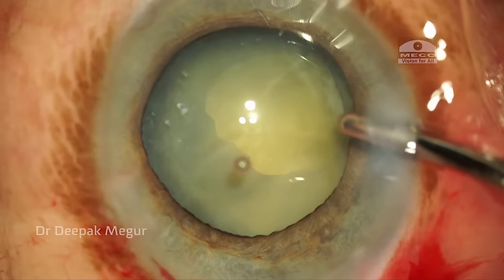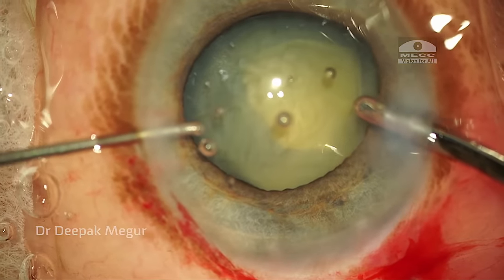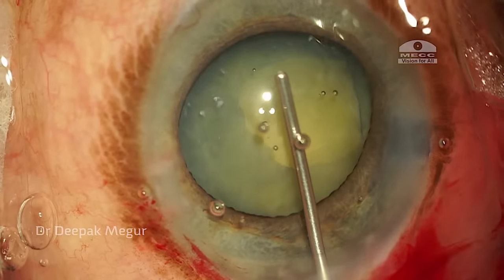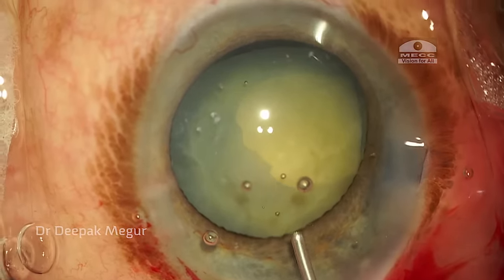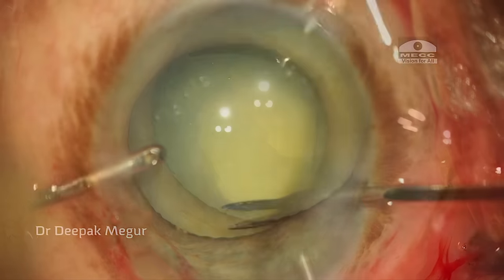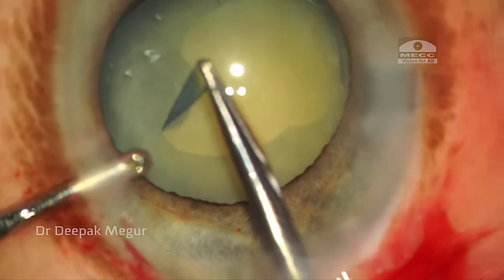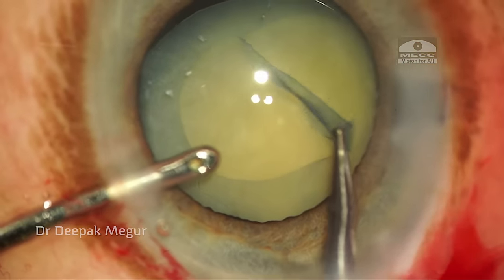Before removing the irrigating handpiece, I don't want to lose the chamber, so I inject OVD through the other end before removing it, filling the chamber with a little OVD. Now the plan is to enlarge the anterior capsulotomy opening a little bit using micro scissors — I make a small tangential cut on the anterior capsule, then using the Haldipurkar forceps, I enlarge the capsulotomy to an adequate size.